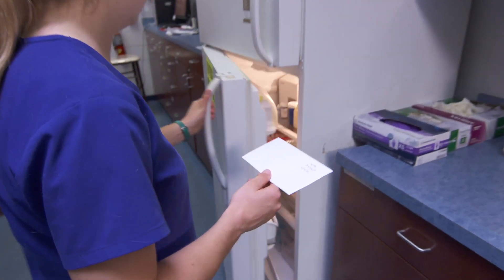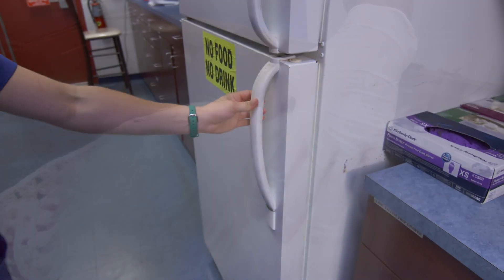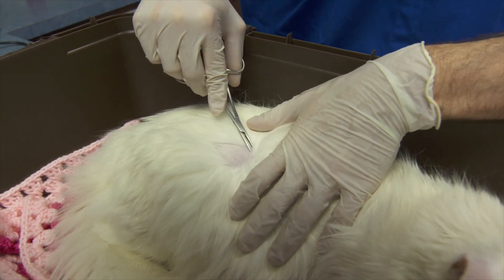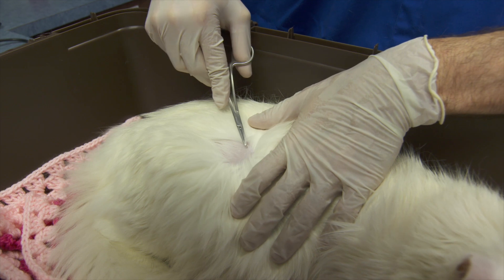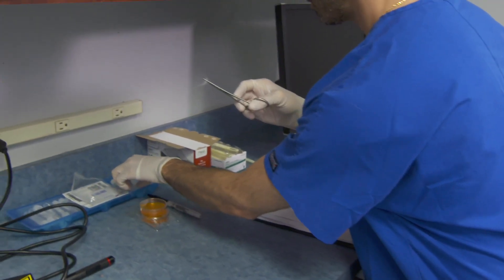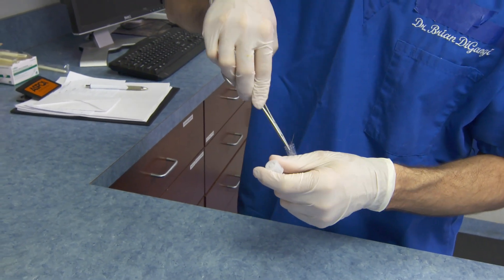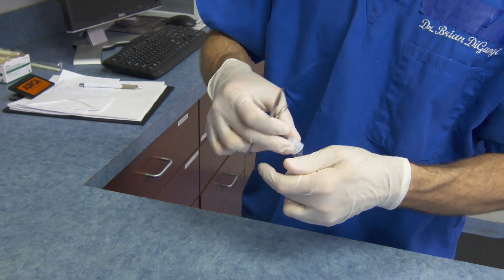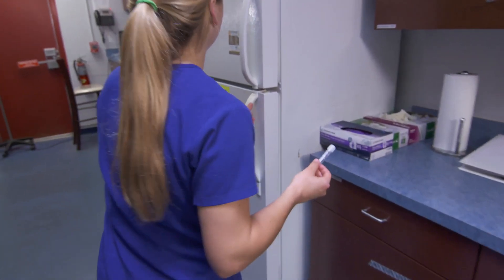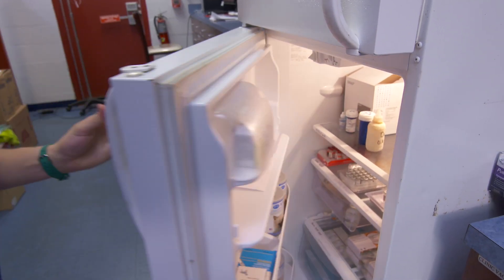Place the prepared sample in the refrigerator until submission to the diagnostic laboratory. Method 4: Diagnostic Laboratory. When obtaining samples for PCR testing, gently pluck hairs that fluoresce under Wood's lamp examination or those from the edge of suspicious lesions. Collect a minimum of 10 to 20 hairs and place them into a sterile sample tube, labeled with the animal's ID number and date of collection. Place the prepared sample in the refrigerator until submission to the diagnostic laboratory.